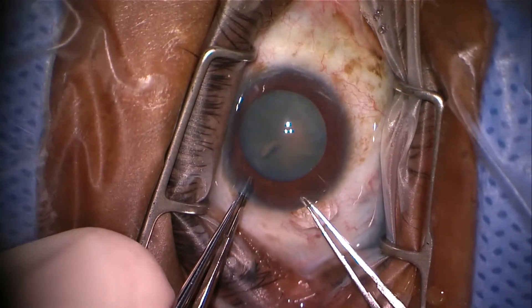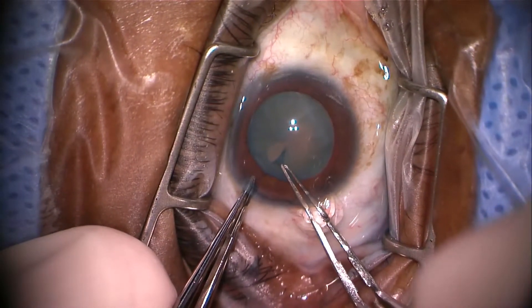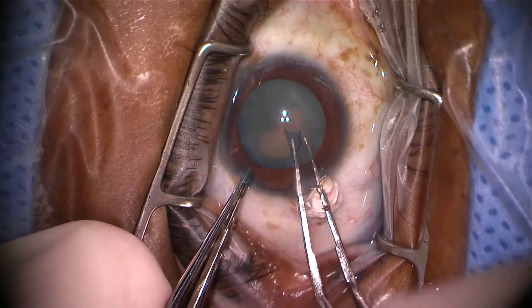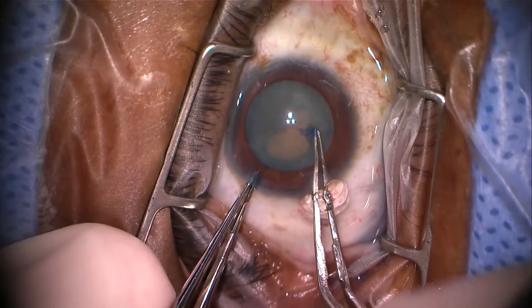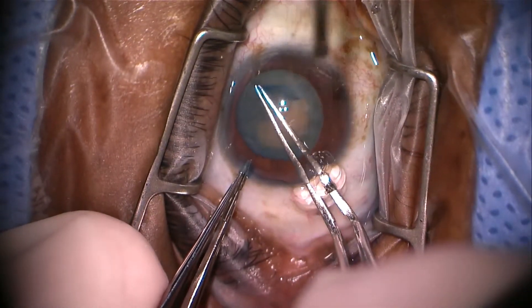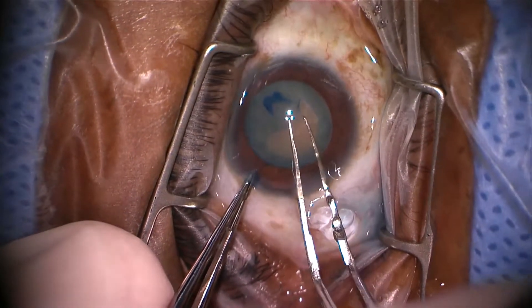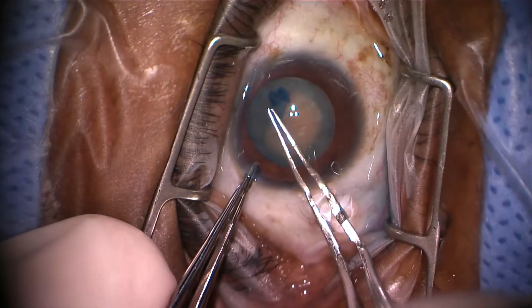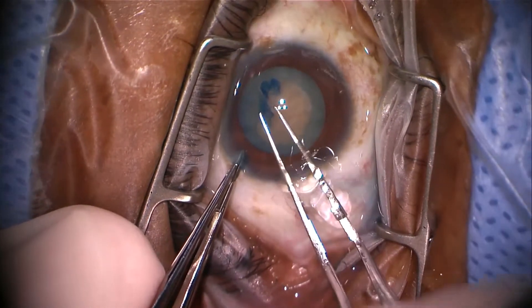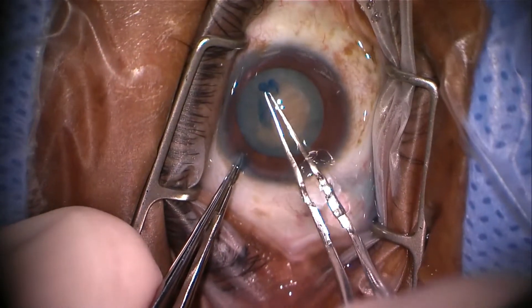During these steps, you'll see that I have the 0.12 still through the paracentesis. I do that in almost all my cases just to keep the front of things nice and stable, because we're doing almost all these things topically and I don't want them moving around. A lens that needs TriPan Blue will sometimes have a capsule that is very friable — or brittle, maybe is a better term — and so a small tug on the capsule will often result in a big tear, so be careful with that.